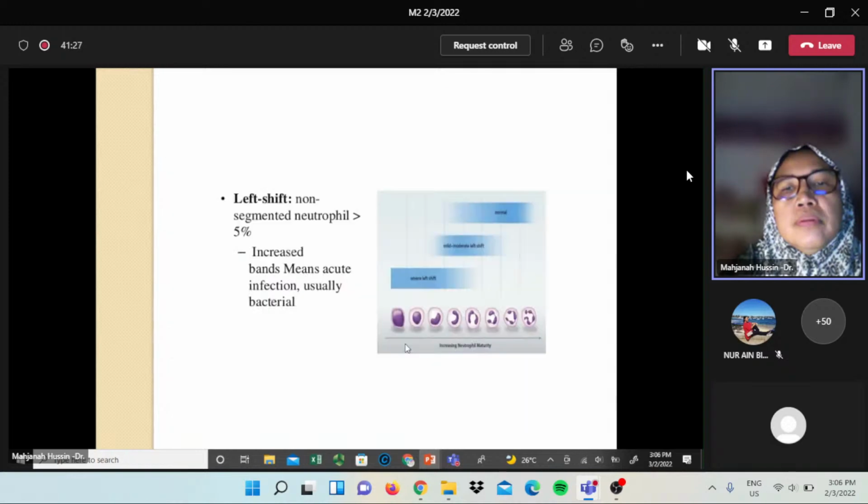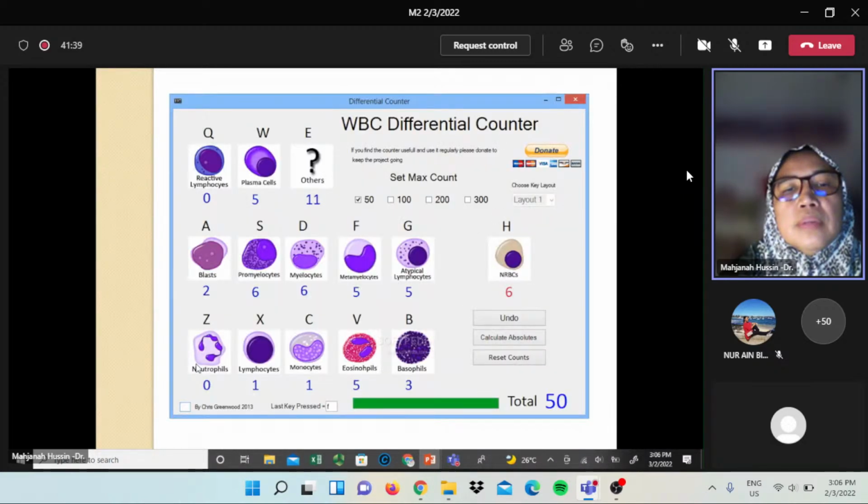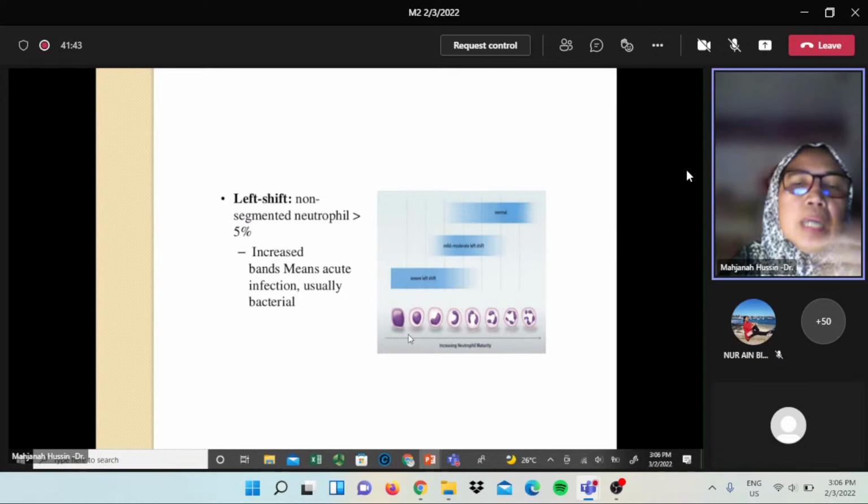So now you have your cell, from the one which has a very big nucleus to the one which has a very little one. So what cell is this? This is neutrophil. Look at that, neutrophil. Now, if you see a lot of neutrophil like this, this is mature neutrophil. If you have a lot of something like this, it is immature. That means this is still young.